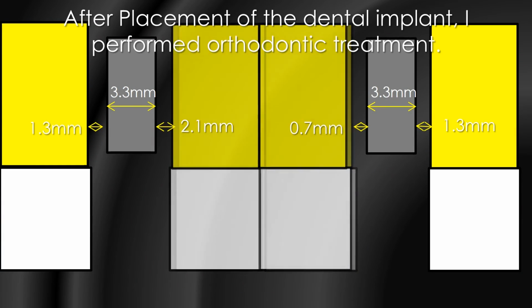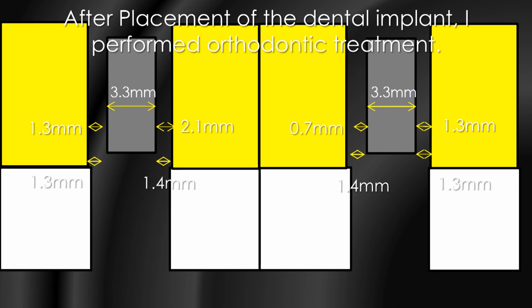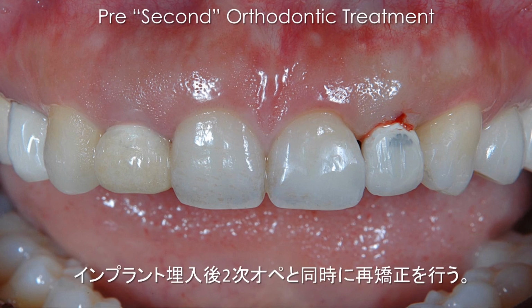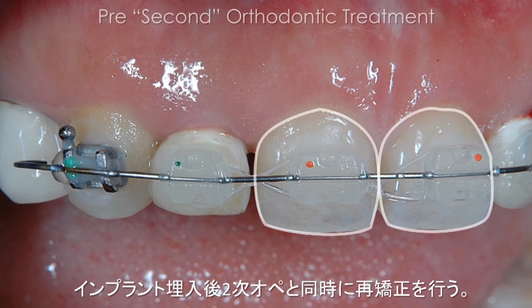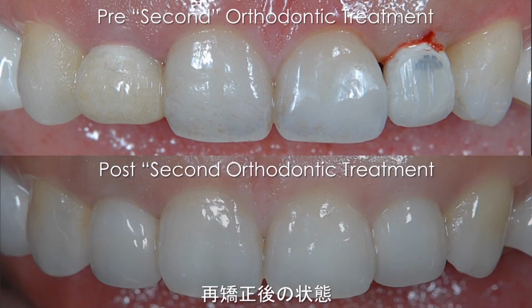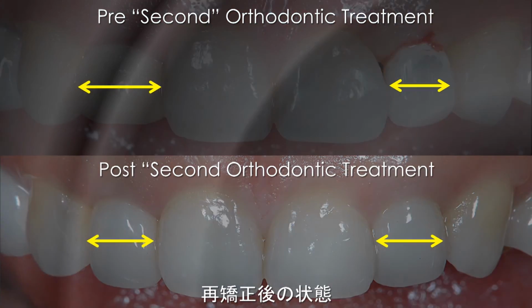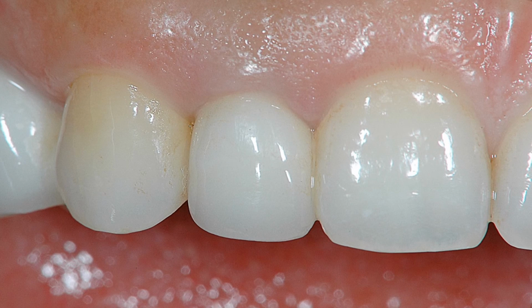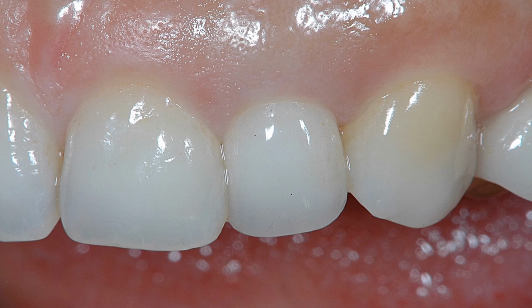After placement of the dental implant, I performed orthodontic treatment. Second orthodontic treatment. So this is after treatment, post second orthodontic treatment. So good, a very good result. This is the right upper lateral incisor area. This is the left upper treatment result.